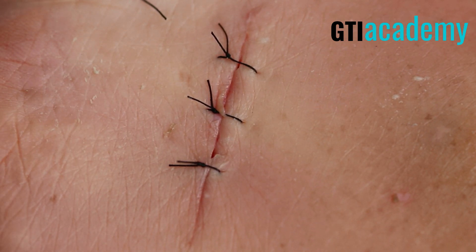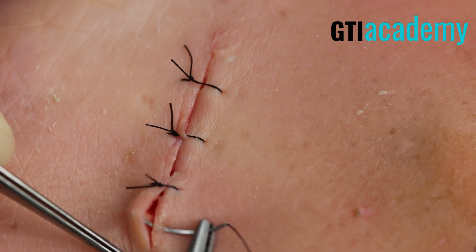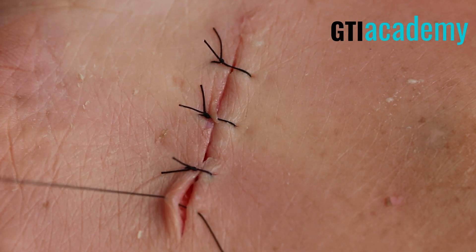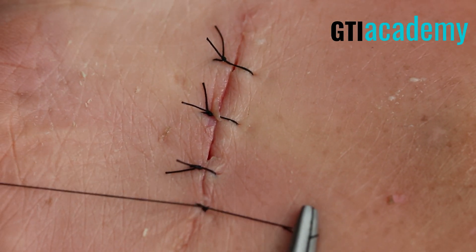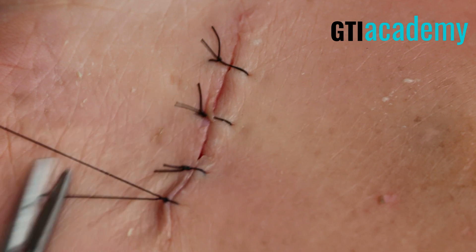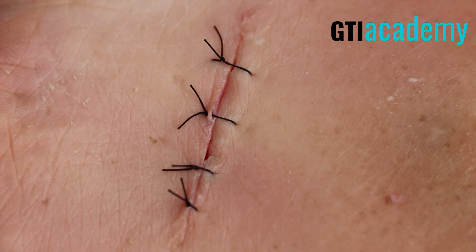Notice the wound does look approximated, but I'm going to throw a few more here to get this tissue a little closer. Measure this suture to the end of the wound and take half the distance. Right now I'm using 2-0 silk — it's a really popular suture. I'm actually using a larger needle here so you can see; I'd really prefer a smaller needle, maybe a 3-0, for this small wound. But for demonstration purposes this needle will suffice.